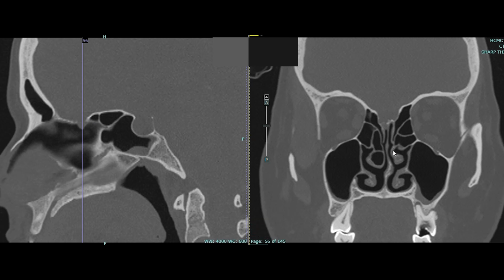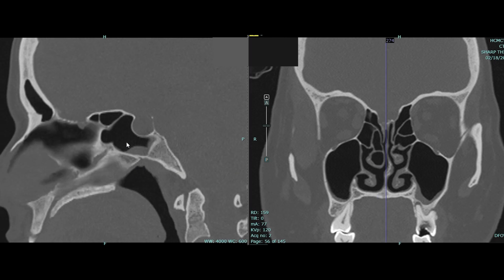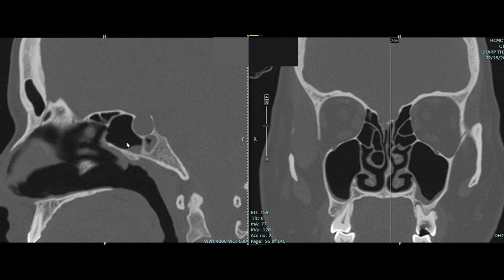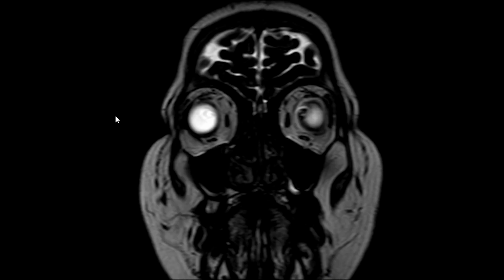This patient has had a history of right-sided spontaneous CSF rhinorrhea. This has been confirmed on the CT, and later on, as we will see on the MRI imaging, one can see a small meningocele that is herniating out of the anterior skull base defect at the level of cribriform plate, which also happens to be the most common site of skull base defect.